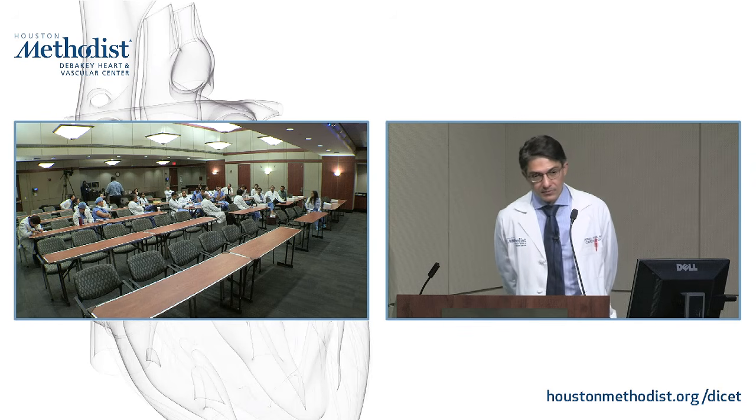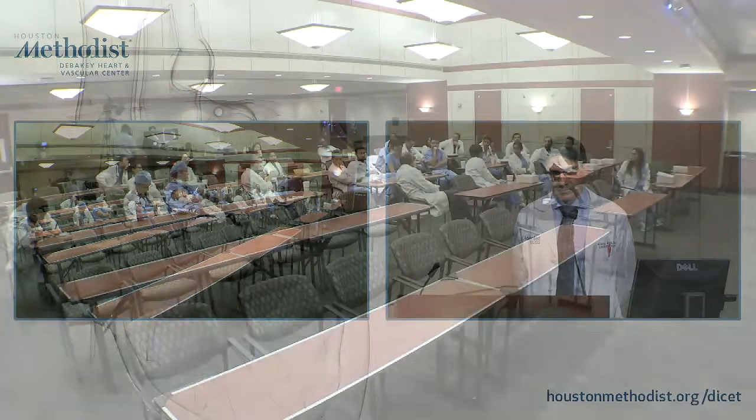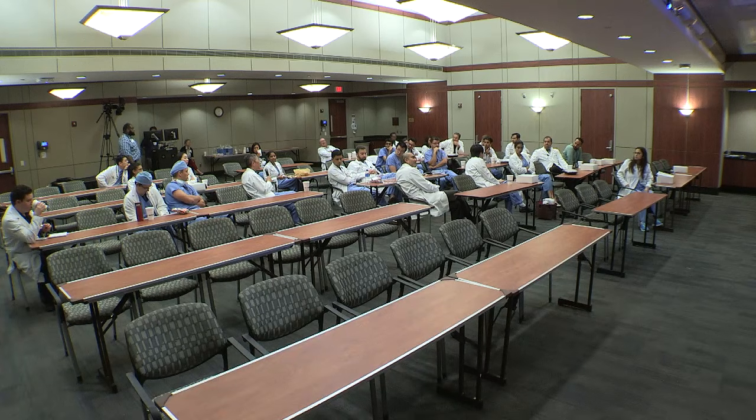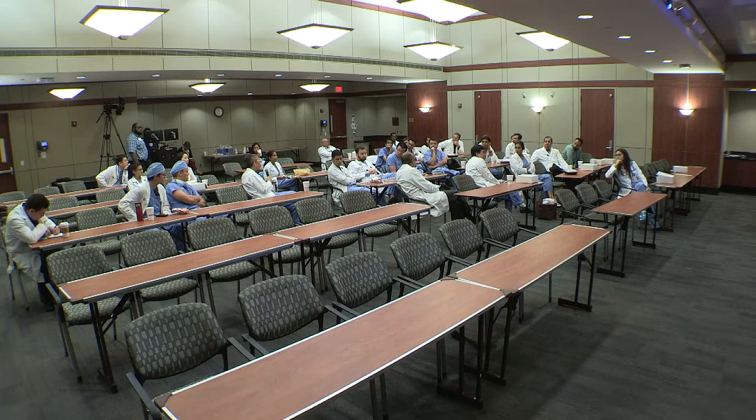With flash mode, we are not getting an X-ray-like dosage. The main reason is that our definition of calcium currently used is 130 Hounsfield units or higher using 120 kV. As Faisal mentioned earlier, calcium reacts differently to different energy, so everything we use is based on 120 kV imaging. Exactly.